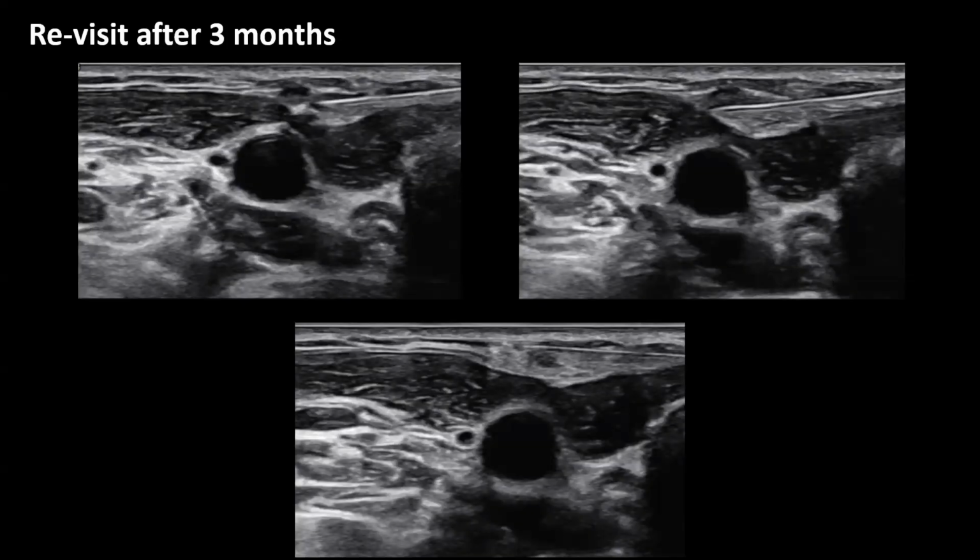The patient arrived at the hospital 3 months before her scheduled ultrasound follow-up, which was scheduled 6 months later. Because the lesion was touched and disturbed all the time, the patient desired to have it removed. I therefore carried out a radiofrequency ablation. This is the recurrence on ultrasound. It's right under the skin.